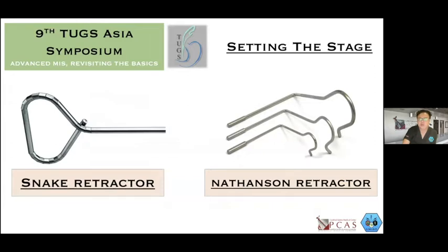Especially for liver retraction, it would help if you have your snake retractor or your Nathanson retractor. If you don't have it, there are other ways and means for you to be able to retract that liver, and I'll show you later on some procedures on how we would do it.